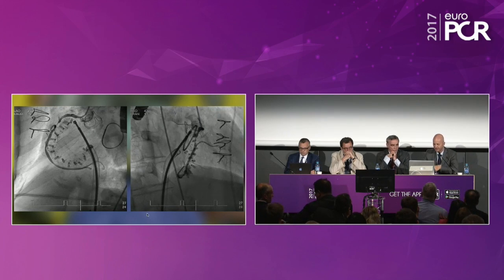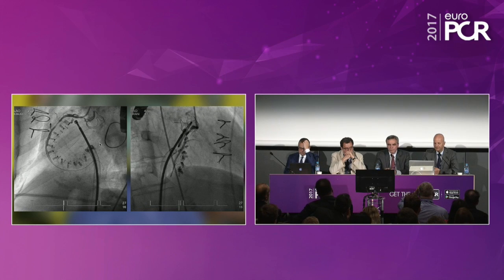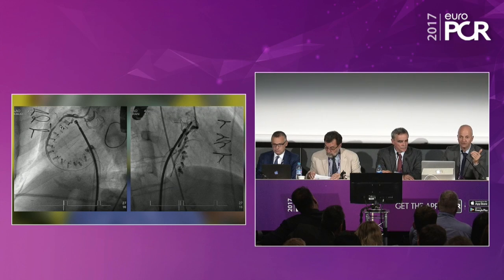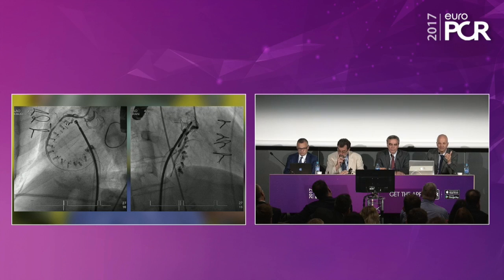We discussed that yesterday. Maybe I stop here for a second. You can see the right coronary artery. When you start the cinching, of course, you also foreshorten the right coronary artery. You can encounter some spasm here, and I will even show you some kinking later on. We have seen that in any of our patients, in the 10 patients we have treated so far, but we never encountered any issues with the patient. No troponin, no ECG change. There is slight troponin because you're implanting these anchors, but we never saw any clinical issues with that.